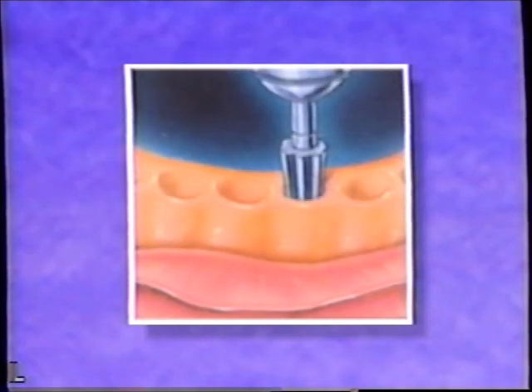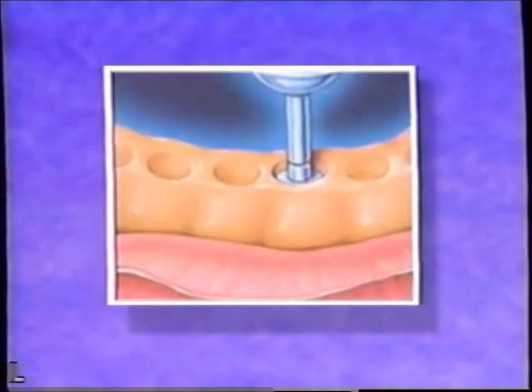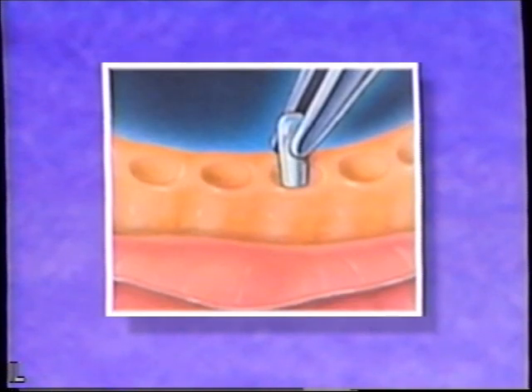There are 8 different sizes of cones that correspond to 8 different sizes of drills. The drills then are approximated size-wise to the socket. Whichever drill is most closely the size of the socket in question is put on a contra-angle handpiece, and with contra-angle drills, the socket is shaped, if you will, to exactly conform to the size of the implant, or ERMI, they call it, that will go in it.